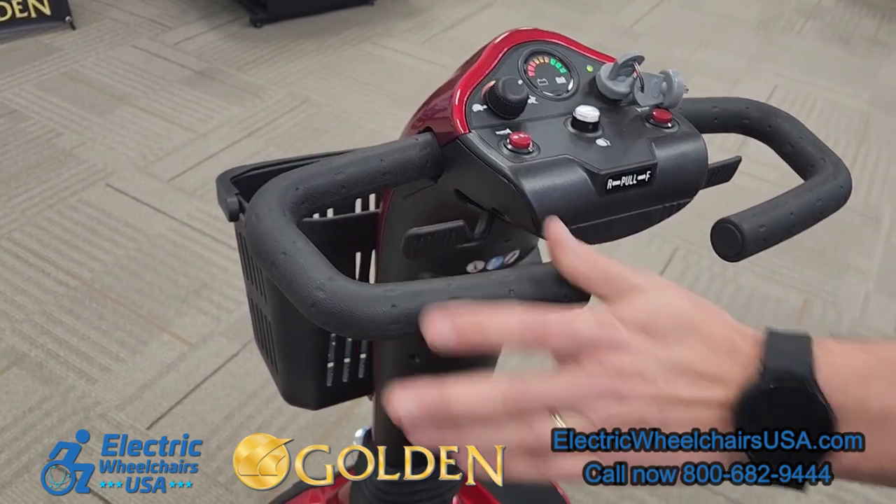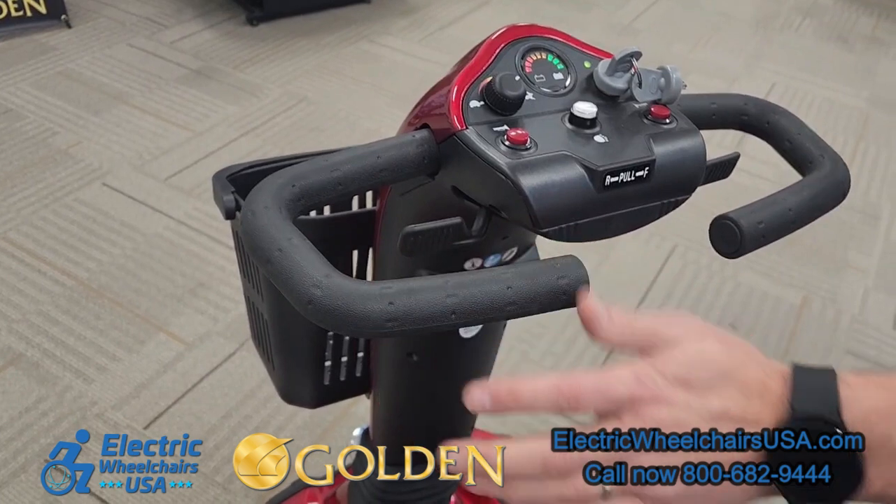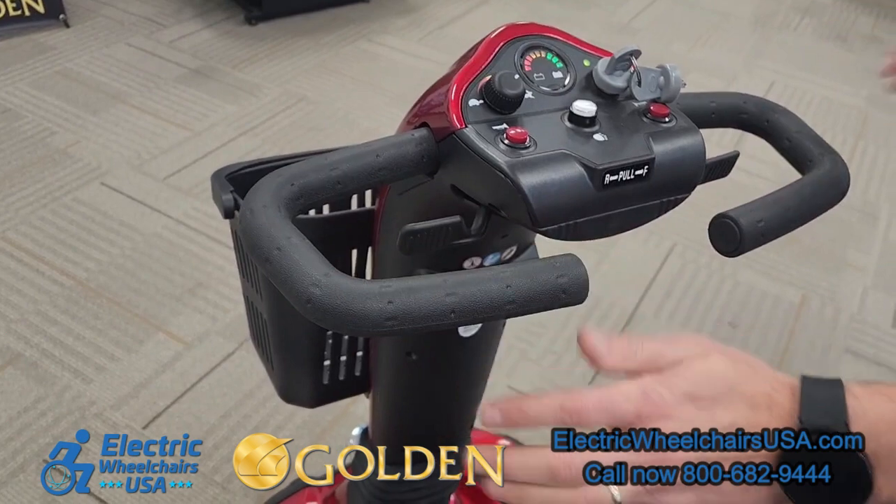On the tiller, it is a delta tiller, so it wraps around into an oval shape — that's great for people with limited dexterity. The crossbar that's closest to you allows you to rest your wrists on there and operate the scooter.